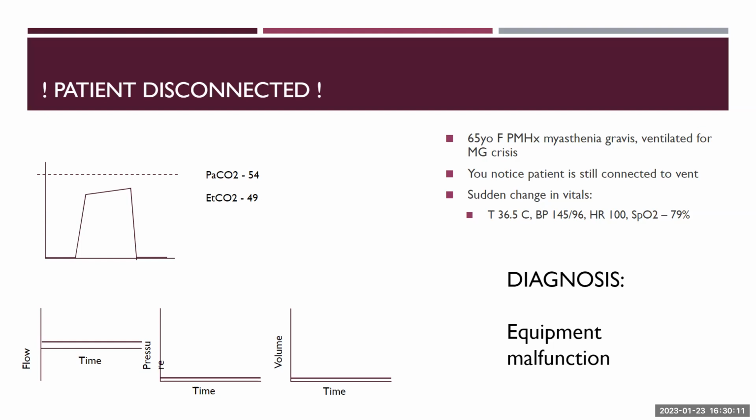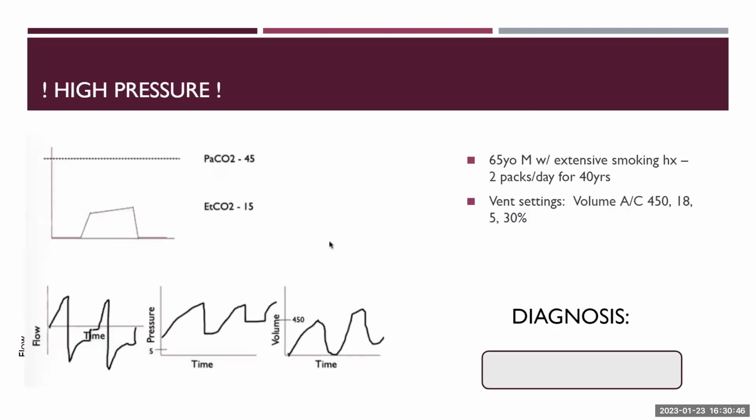should definitely be: is the machine okay? Machines are machines. It's an easier fix to fix a machine than to go through everything that could possibly be wrong with your patient. And it's much easier to go through everything that could go wrong with your patient if you know that the machine is working pristinely. So don't forget to check whether there's an equipment malfunction as a bigger part of your differential. It's also faster to rule out than a lot of other things.